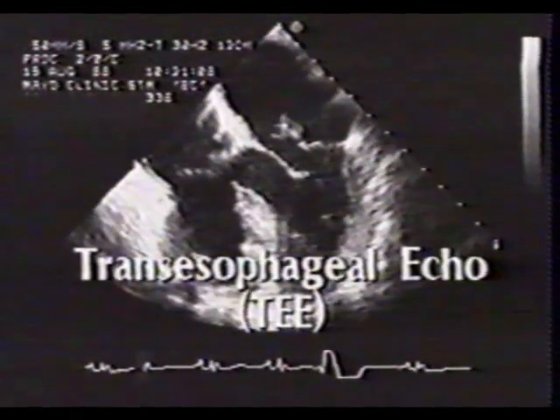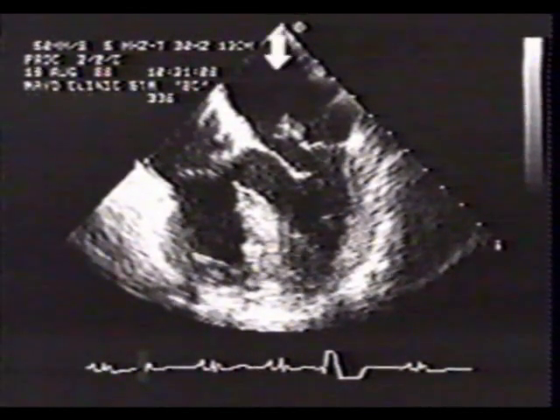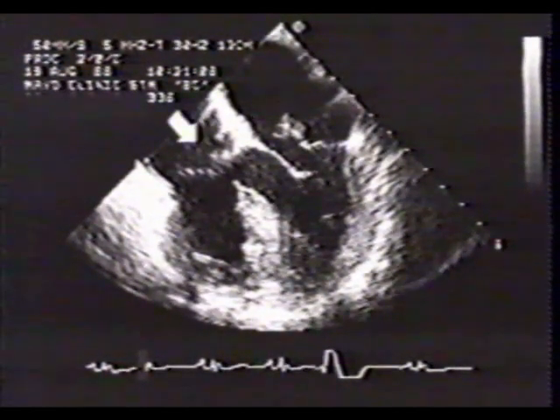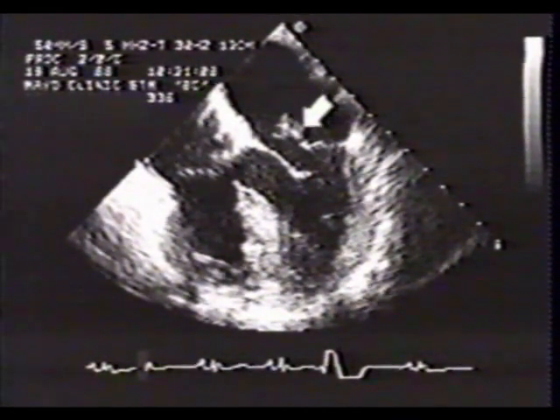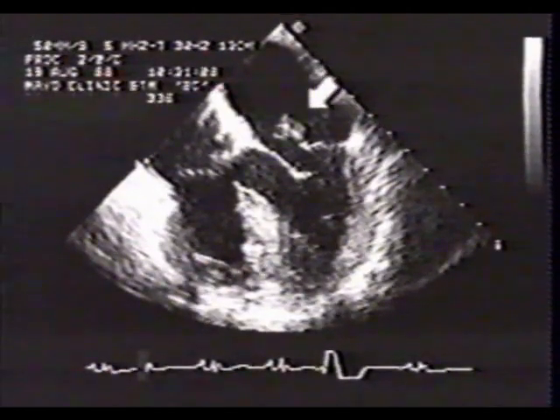The patient was intubated and an intra-aortic balloon pump was inserted. Transesophageal echocardiography was then performed. The transducer is in the esophagus, behind the left atrium. This is the left ventricle, and right atrium. The ruptured papillary muscle head is clearly seen, attached to the flail posterior mitral leaflet in the left atrium.